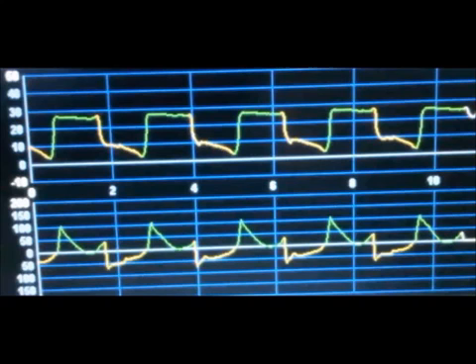However, that is all dependent on what pressure control level you're targeting. So there's a misbelief that you cannot have flow asynchronies when using pressure control ventilation. However, you can have flow asynchronies during pressure control ventilation. And now I'm going to show you an example of this. So here's pressure control ventilation, as I stated before.